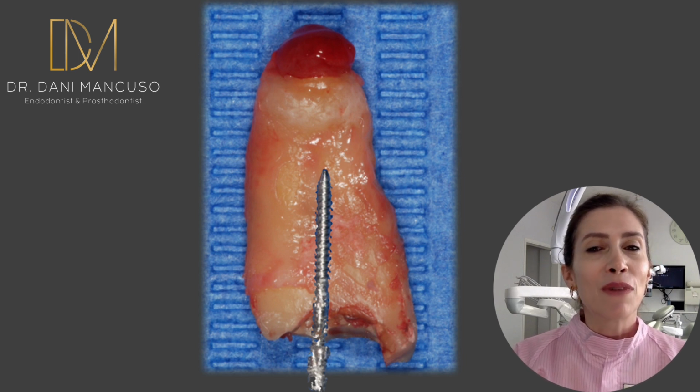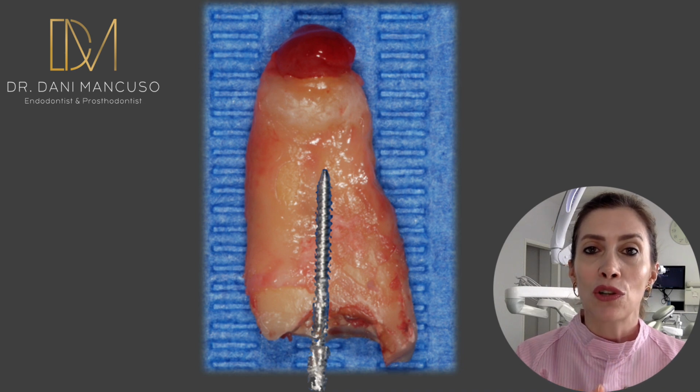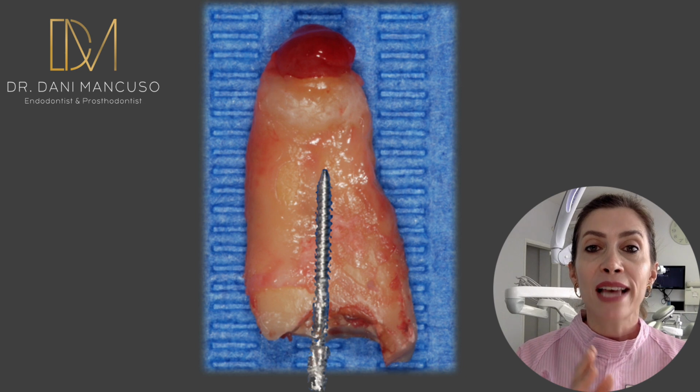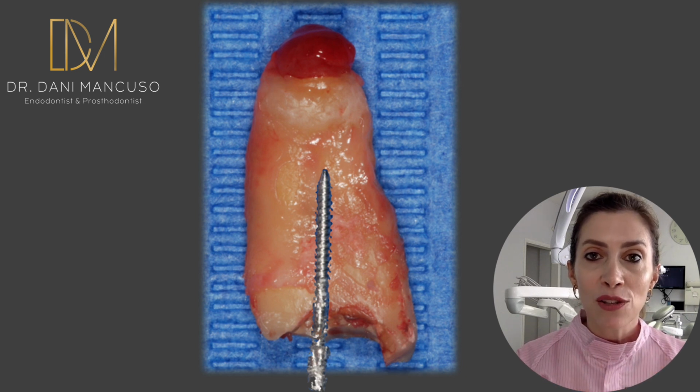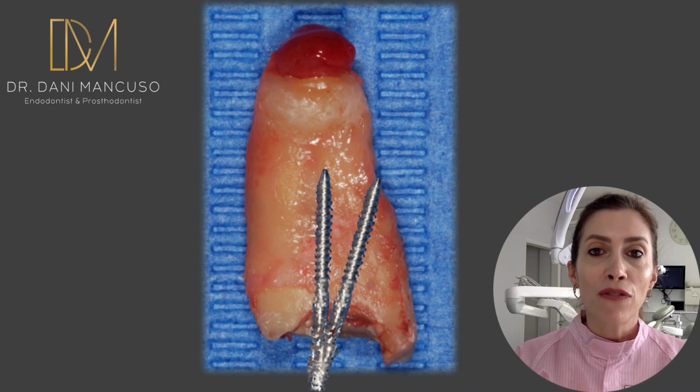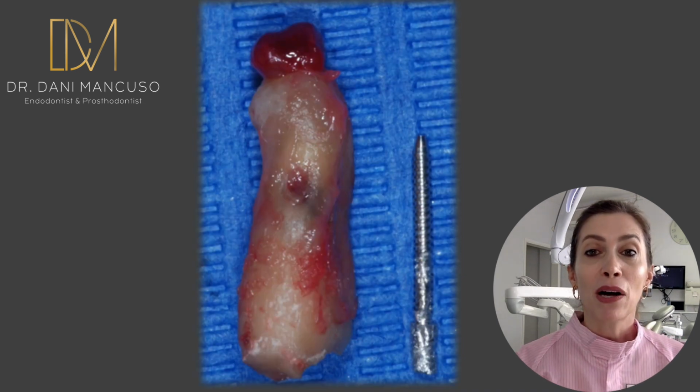Or remember that the x-ray only shows mesial and distal. And what we need to think about is in three-dimensional, because we always have the buccal and the palatal aspect of this tooth. So although it looks centered in the middle of the mesial and distal, it was not. So when we removed the post, we could see that the angle of that post was towards the buccal, and that radiolucency just confirms what we expected. It's a buccal perforation in the mid-third of the root, caused by the wrong angulation of that post.